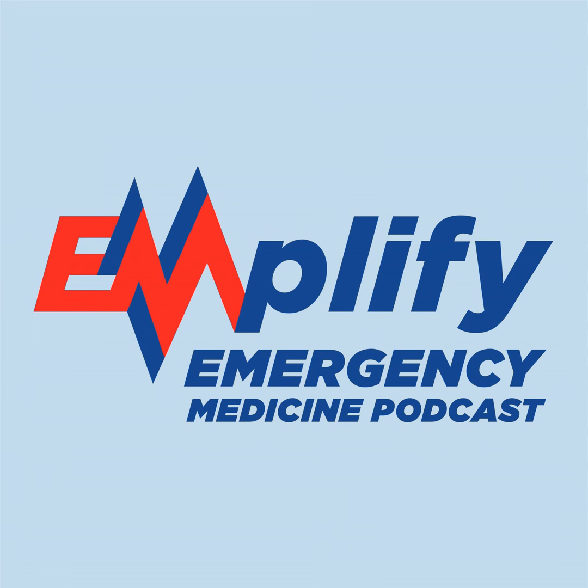And this becomes relevant, like you said, for patients with obstructive physiology. So if I'm getting ready to intubate somebody with asthma or COPD and they're already breathing at 60 times a minute, and then the ventilator is going to be delivering a breath every time they initiate one, I have to be cognizant of that fact after I've intubated them. If they're not adequately sedated or even paralyzed, they might actually get 60 full breaths in a minute if they're still breathing at that rate after being intubated, because the ventilator is going to try to give them the entire tidal volume with each of those breaths.